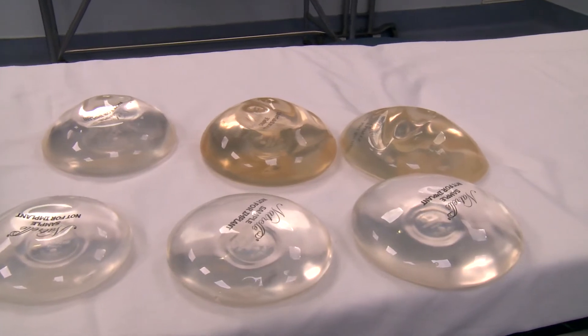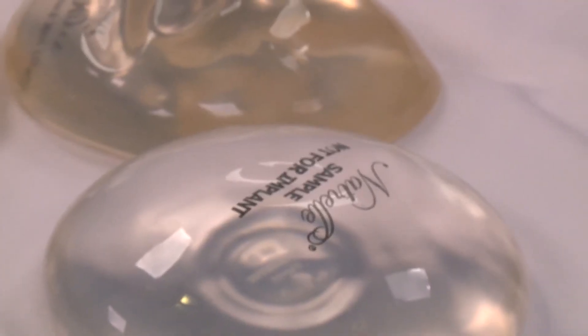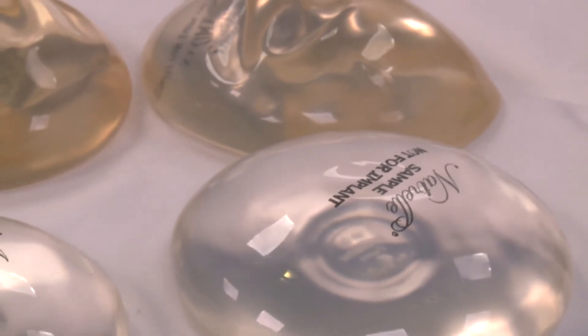Sizing these patients preoperatively is really important. I take patients in the office and we will basically size them. We'll put an implant in a bra and look in the mirror and see what they look like. But in the operating room is where I really figure out that size for them.